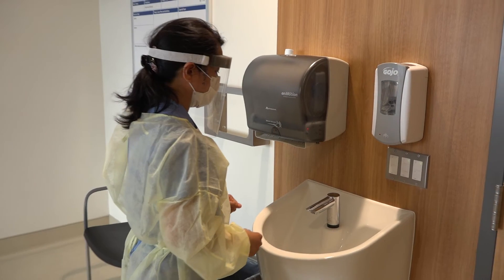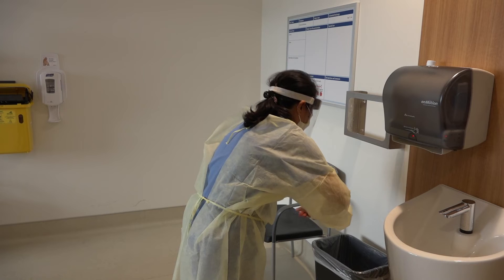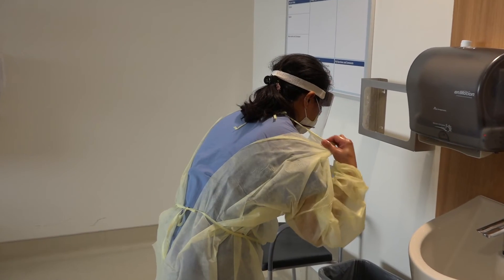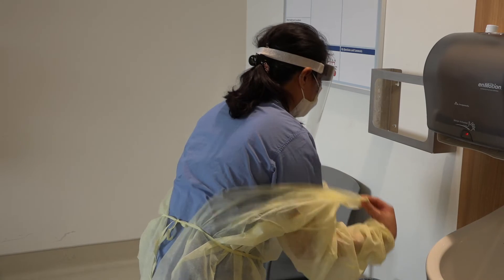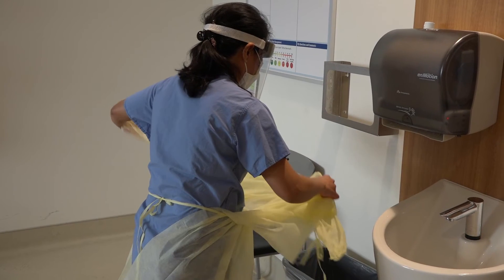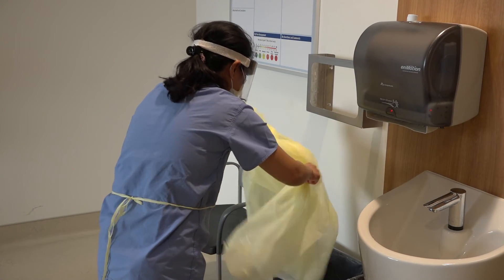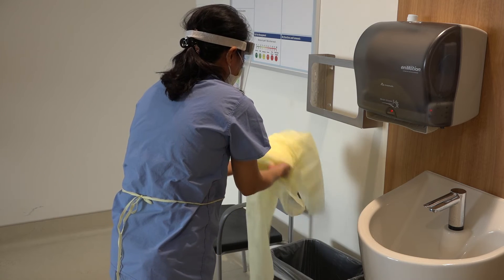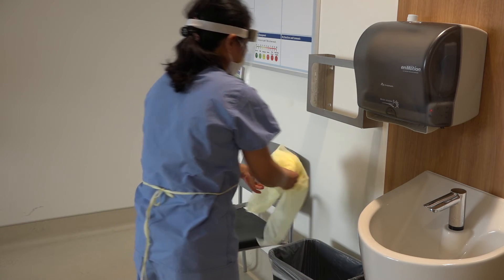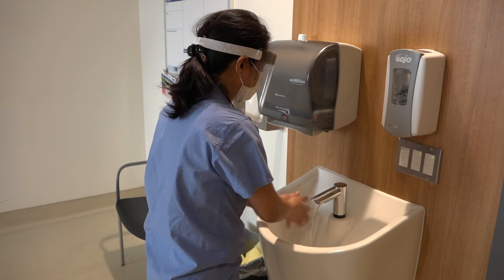The next step is removal of the gown. Note that she leans forward and peels the gown off of her body so as not to contaminate herself. She reverses the cuff of the sleeve and then rolls the gown up and into the garbage. Once she has discarded her gown, she will then again perform hand hygiene.